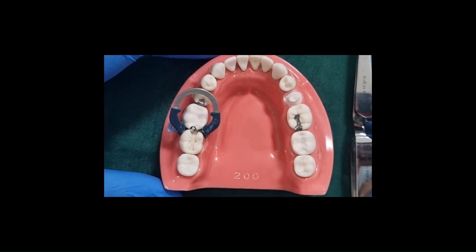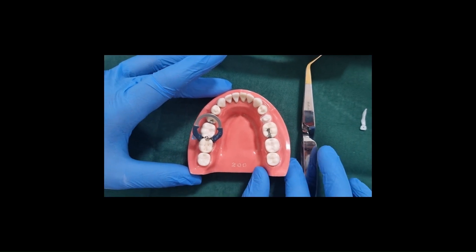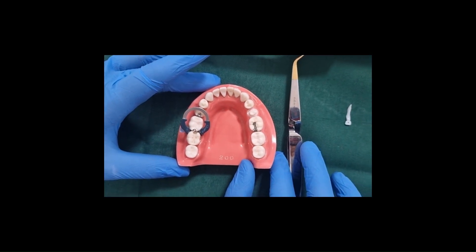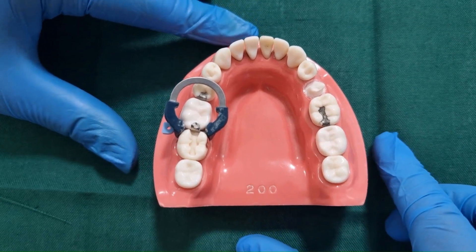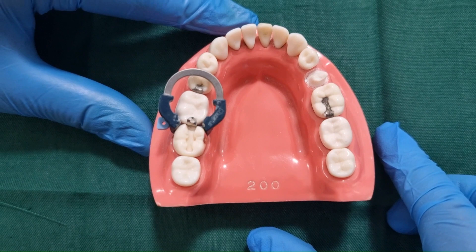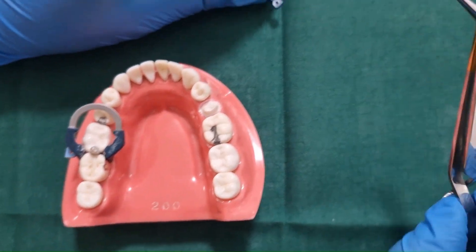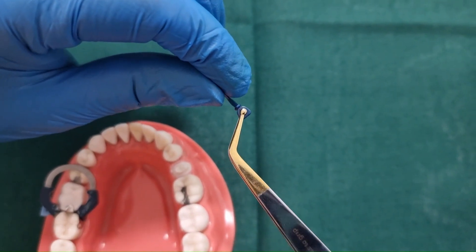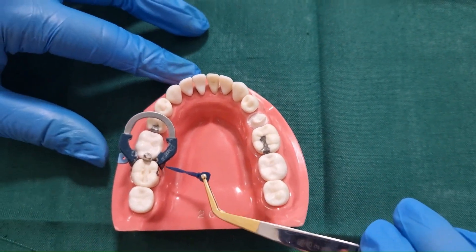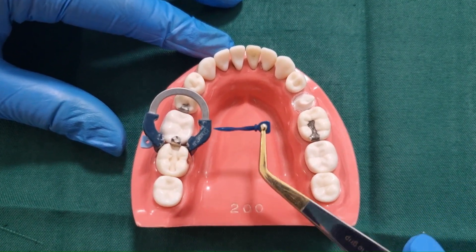Here a mesio-occlusal cavity has been prepared and the V3 ring is kept mesial to the prepared cavity. In case of a disto-occlusal cavity preparation, the V3 ring can be placed on the distal aspect. If necessary, a second wedge can be placed from the lingual side, however it is not required here.